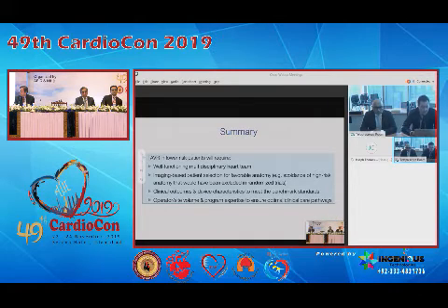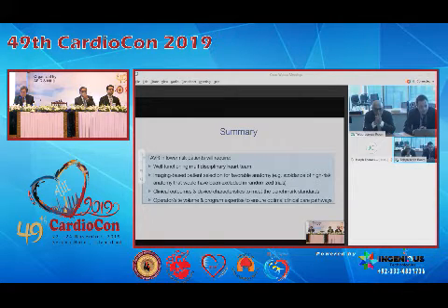And so TAVR in low-risk patients can be done, but I think it requires a very well-functioning multidisciplinary heart team. I don't think every patient who is low risk will go to TAVR, obviously. I think this requires a really measured and decisive approach. Imaging is obviously the most important aspect between echocardiogram and CT, where we're going to select only patients who are candidates in the randomized trials and who have favorable anatomy.